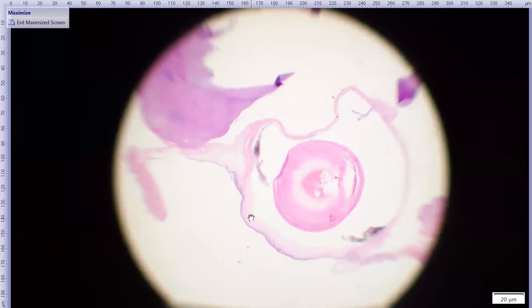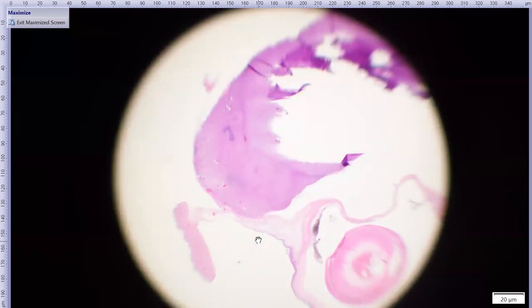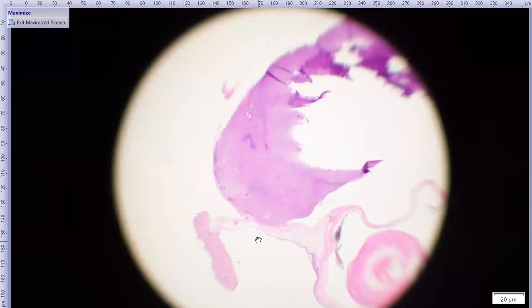there's our sort of sad squished little eye. Right down here, the corneal epithelium is hyperplastic and there's a bunch going on in the superficial stroma, but that's not really the most exciting thing. Here is that mass. Once again, even at this low magnification, you can see how heterogeneous it is with these pockets of more basophilic areas admixed with the pinker areas. There's quite a bit of sectioning artifact in this piece of tissue.